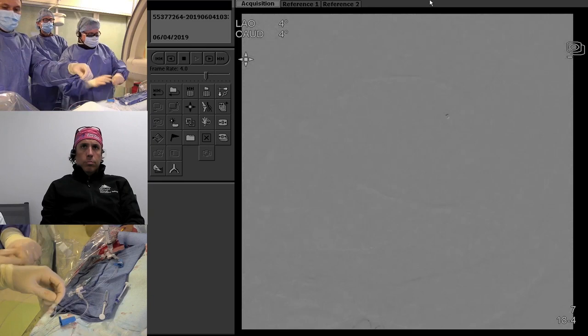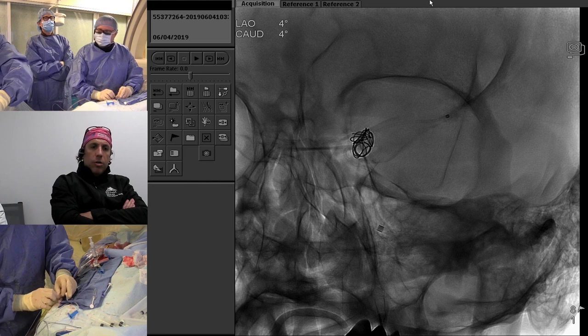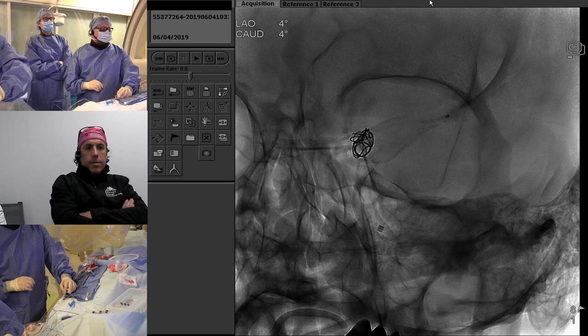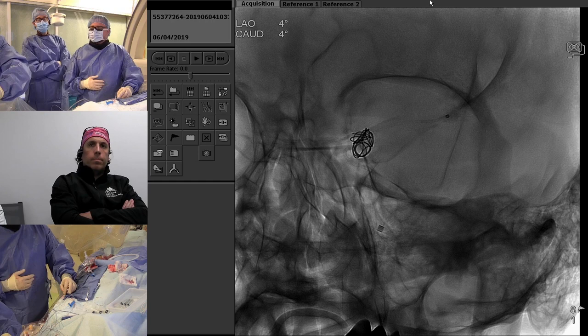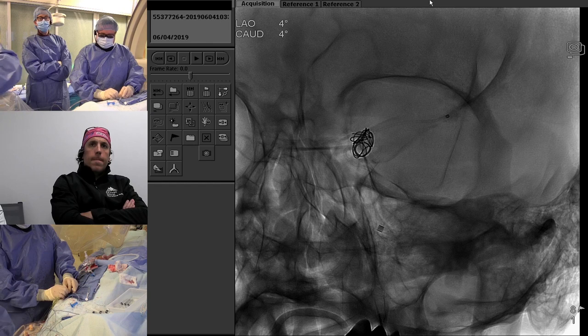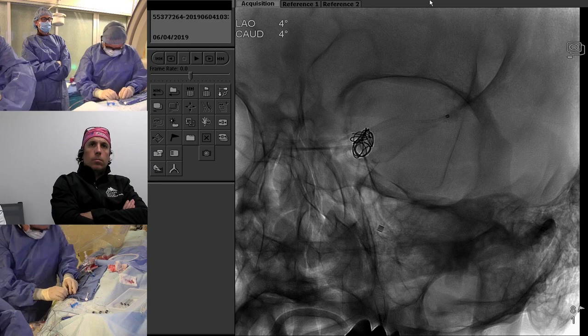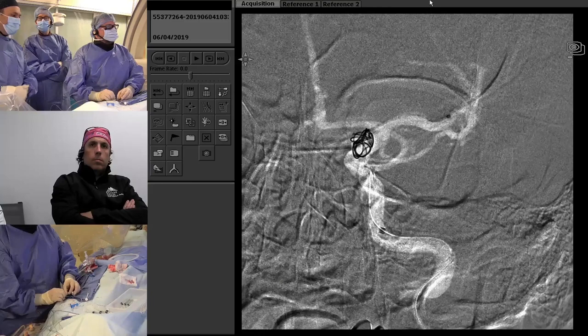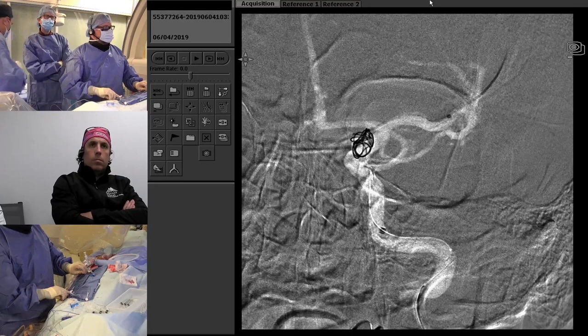How much room do you think you need to do these cases from the radial approach? Close to 100% of the cases work from the radial approach. You need around 10 centimeters extra — remembering that this patient's anatomy is almost straight as an arrow. Taller patients and those with tortuosity and ectasia present bigger problems. Ten centimeters is a good rule of thumb, but hand-in-hand with that, if you lengthen the guiding and intermediate catheters, you need to lengthen the selecting catheters as well so you're not doing 260-centimeter exchanges into the carotid, which creates problems that didn't otherwise exist if you went femorally.